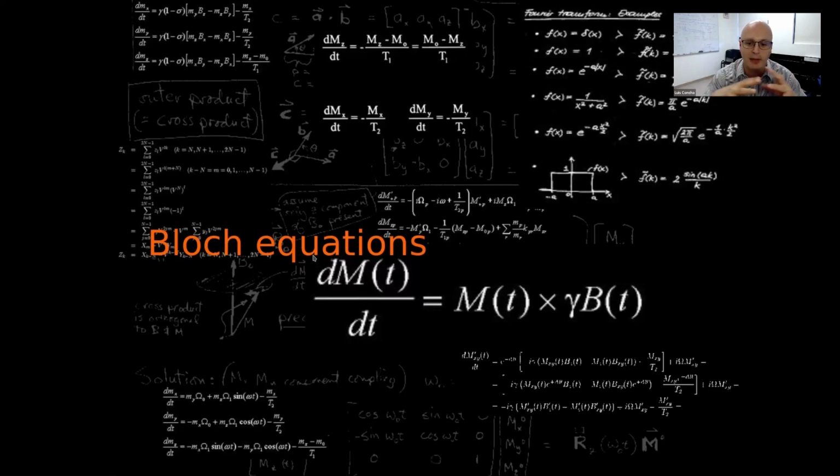It's very interesting, but it's a very compact way to explain the evolution of signal after whatever you want to do with your imaging, whatever pulse sequence you want to do with it, can all be neatly predicted through Bloch equations. And this is the math and the physics that are behind MRI, and it's all a very interesting avenue of study.